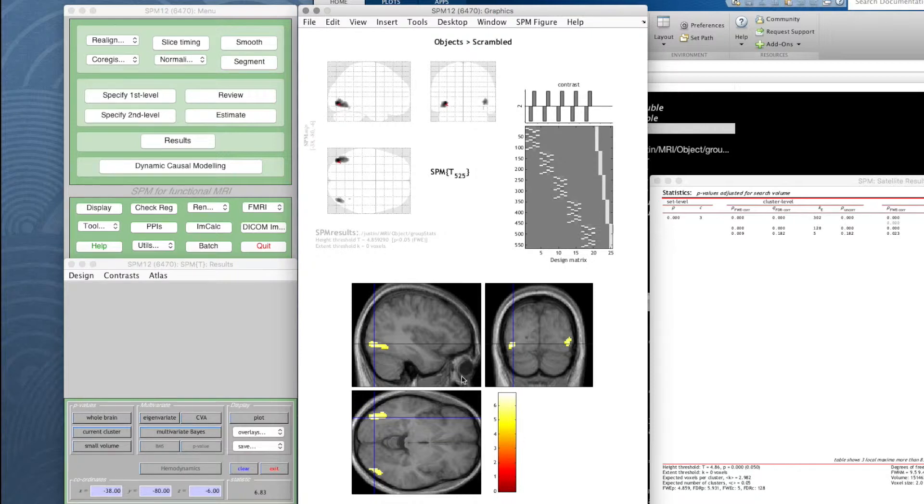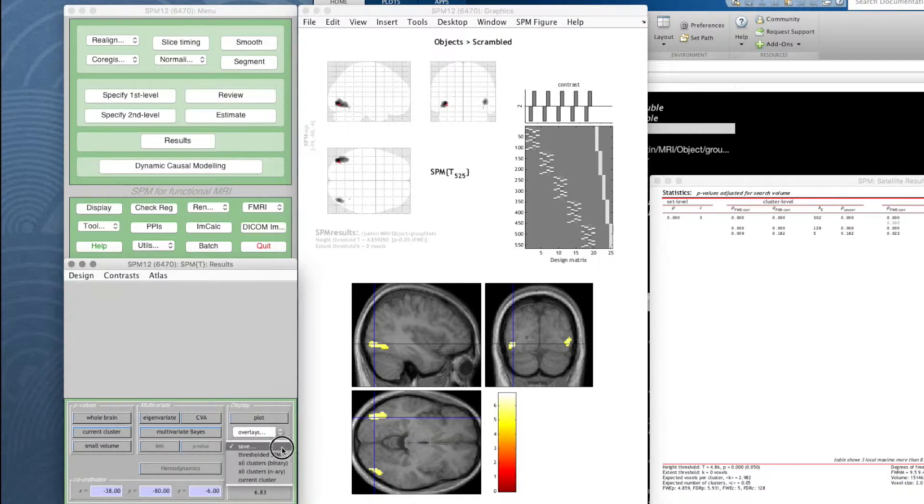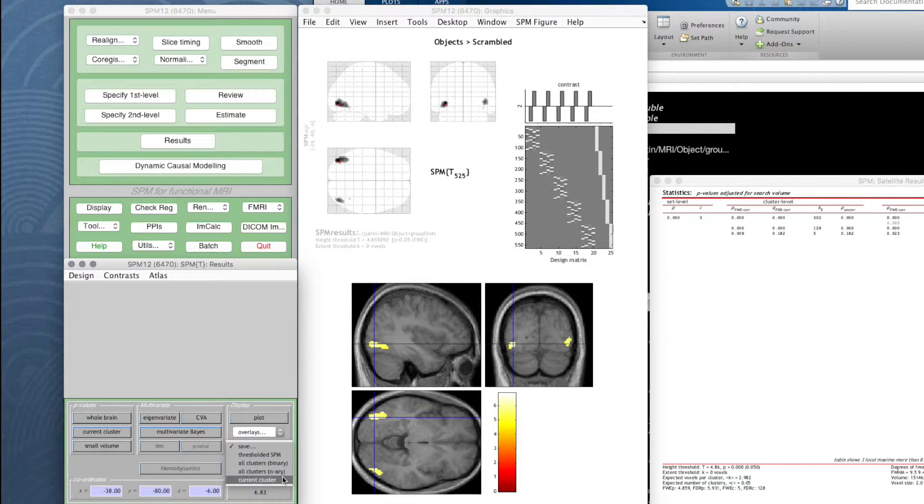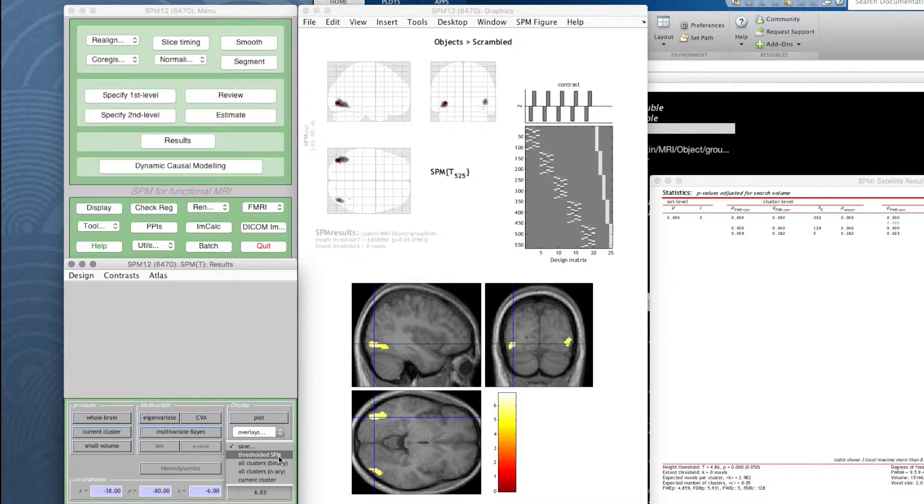So in this results panel here if we go to display and save, it says you can save thresholded SPM, all clusters, binary, current cluster. We're going to save the thresholded statistical parametric map, that is only those blobs we can see here which survive the 0.05 corrected threshold and have a t-value above 4.86.